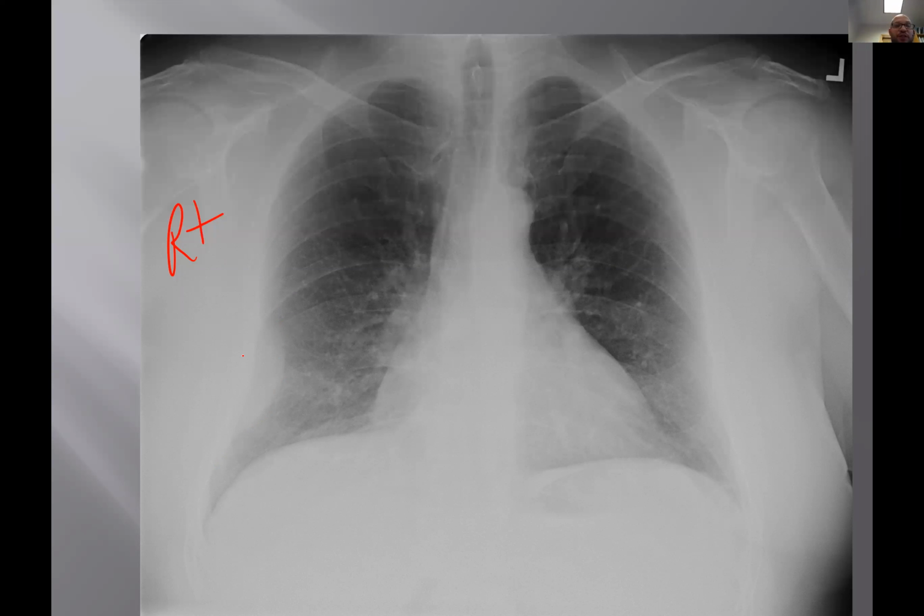In other words, if you have a pathology of the rib, the soft tissues expand, and it sort of has a soft tissue mass that's pushing into the pleura, into the lung. It doesn't get into the lung, but it's pushing the pleura in. It creates that sort of extrapleural sign.